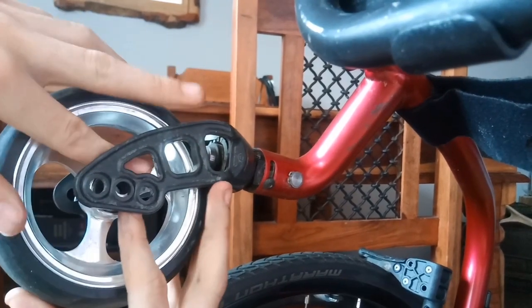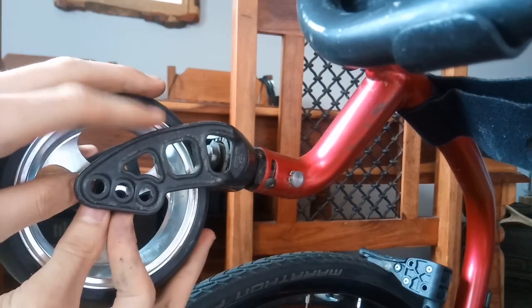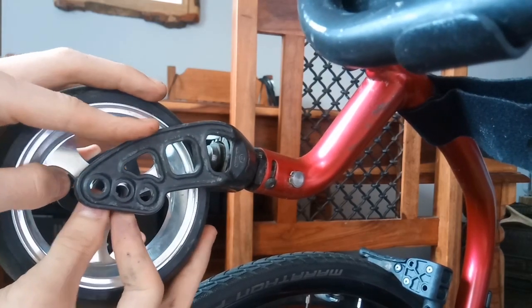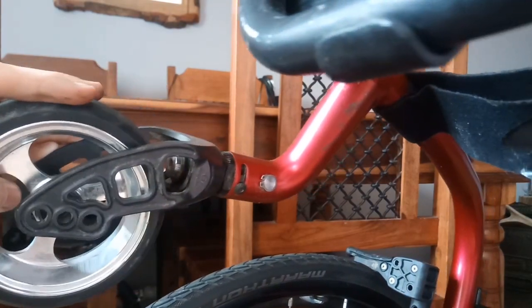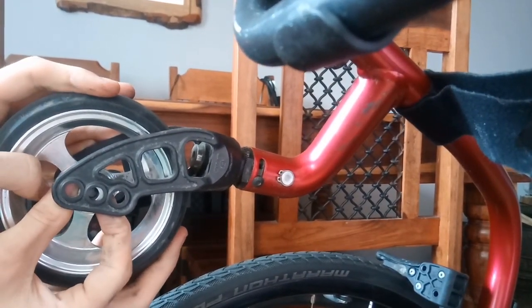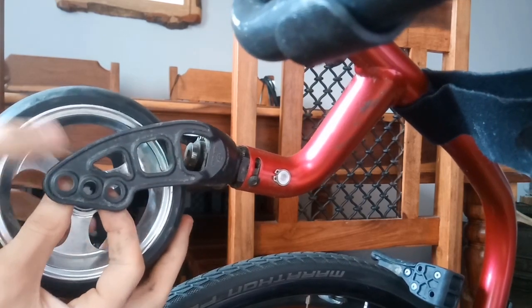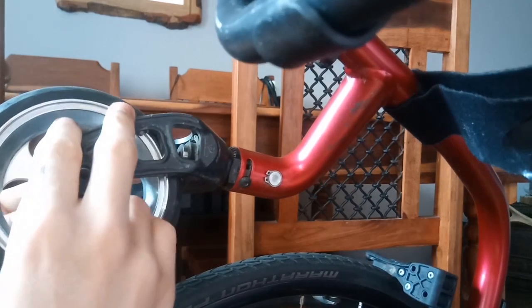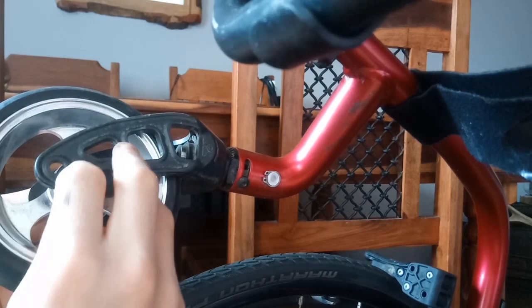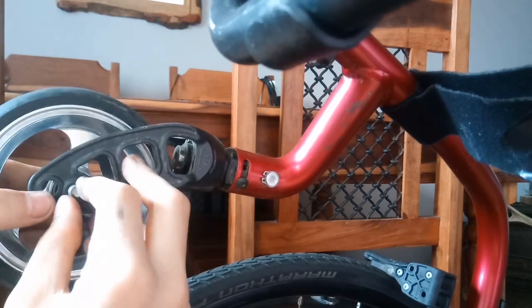Now I just realised that I am very close to the camera, so hi. Kind of doing some wheelchair ASMR maintenance. I just need to quickly see how well this is lined up. So yeah, that seems to be good enough. And then what we're going to do is start kind of screwing it in until it comes through here. And you can see it there. Okay.